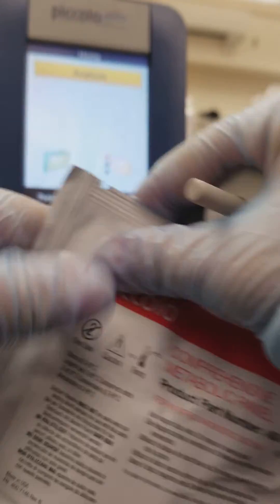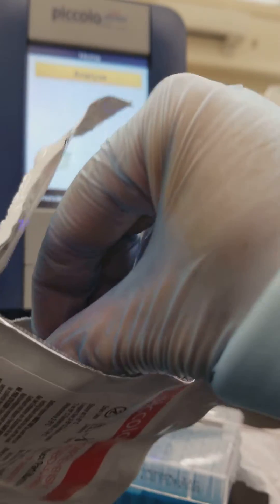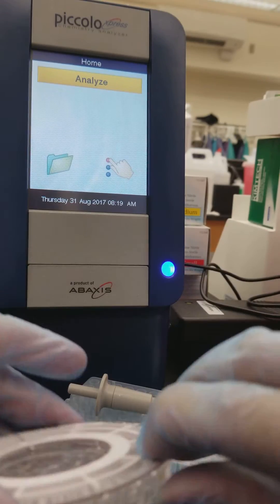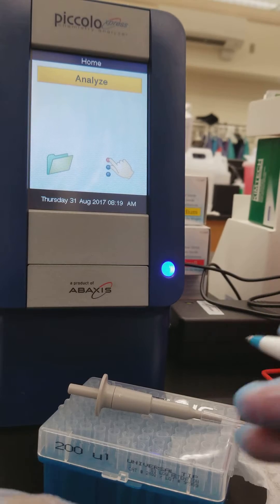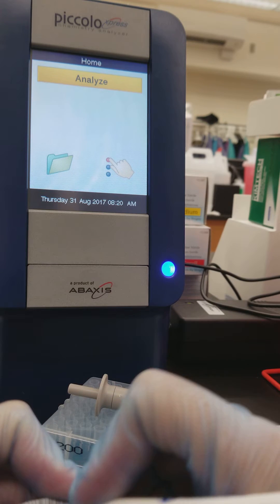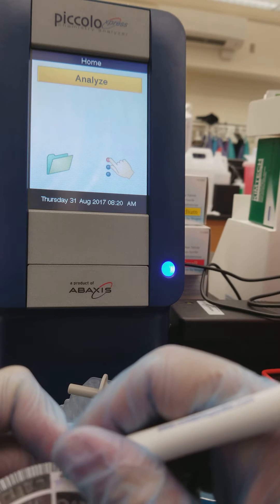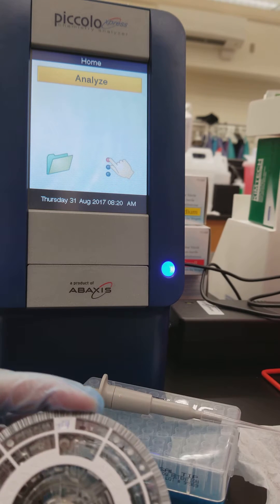So we are going to open this now. The screen showing on the analyzer in the background is the home screen. As soon as you turn it on with this button, the screen will light up and it will tell you that it's running internal QC and that it has to warm up itself first. You'll automatically hear that fan going to make sure that the computer inside this analyzer stays cool, which is very important.